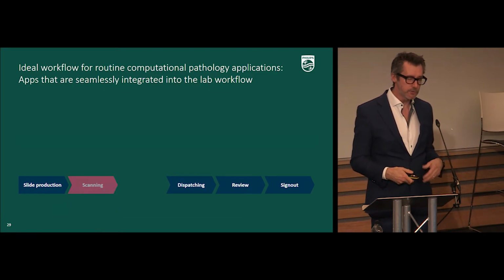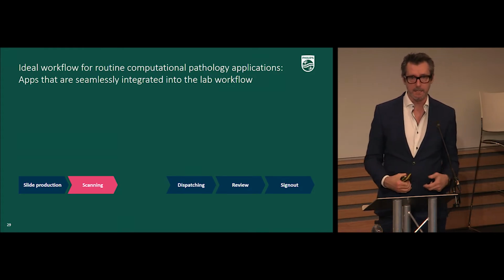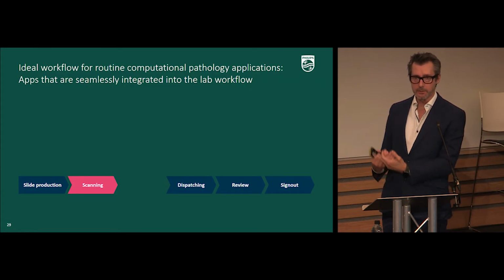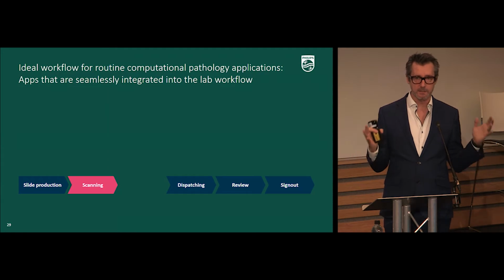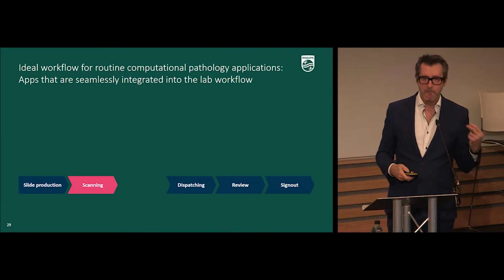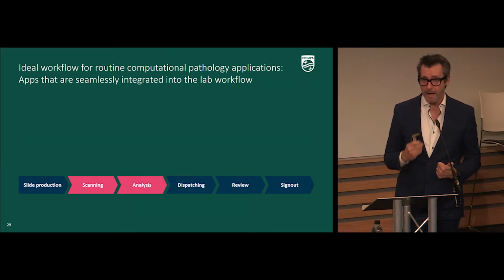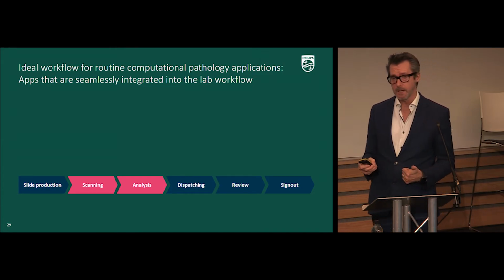We've already introduced scanning into that workflow where all of those slides can be scanned in a high throughput walk-away fashion. So the slides can be delivered to pathologists in a digital way and they can view and make those diagnostic decisions safely in a clinical diagnostic setting. But we're also introducing analysis into that workflow, where as the slides are being scanned, they're also being analyzed at the same time of scanning.